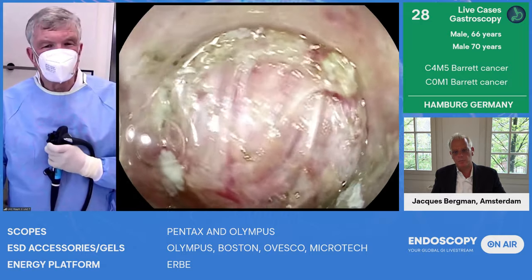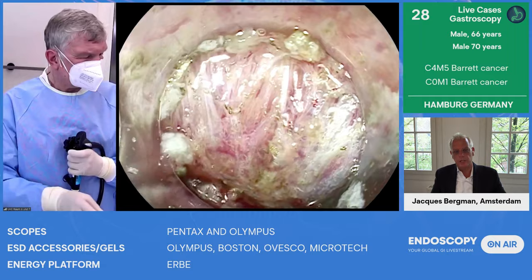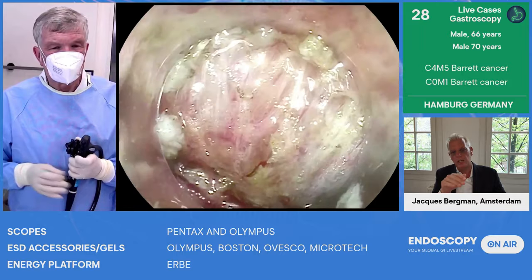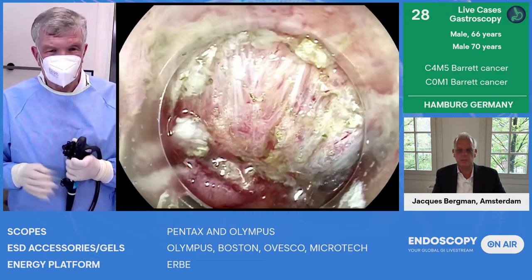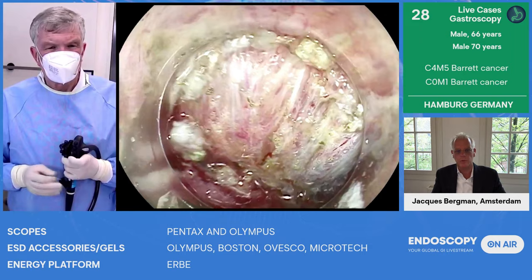Jacques, do you think that's deep enough here? Maybe not yet, huh? So we inject? No, not yet. And you can do this like you're doing now, in the anterograde fashion. That means that you will be dissecting into the anal side, basically towards the stomach. The lesion is at 12 o'clock, or you can do it in a retroflex position, and that will get you underneath the lesion. But it's more difficult.